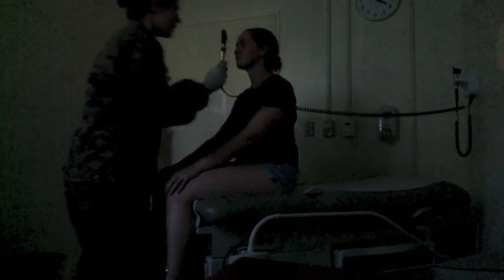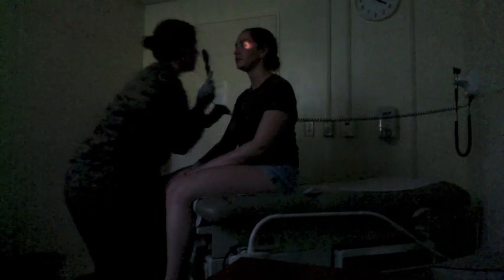So I can visualize her optic disc and her vessels look healthy. I'm going to do the other eye. Optic disc again looks orange, nice and healthy, and I can see the red reflex in both eyes, and I see healthy vessels.